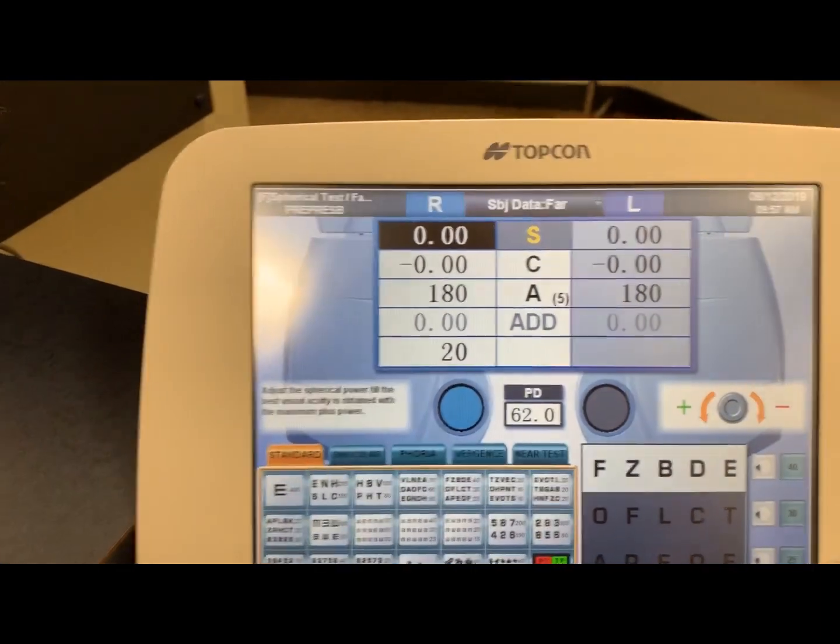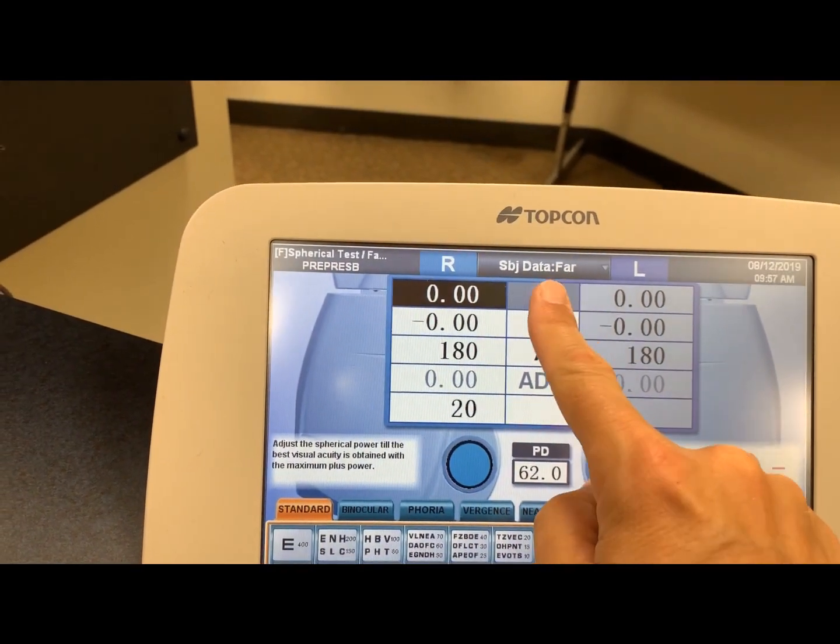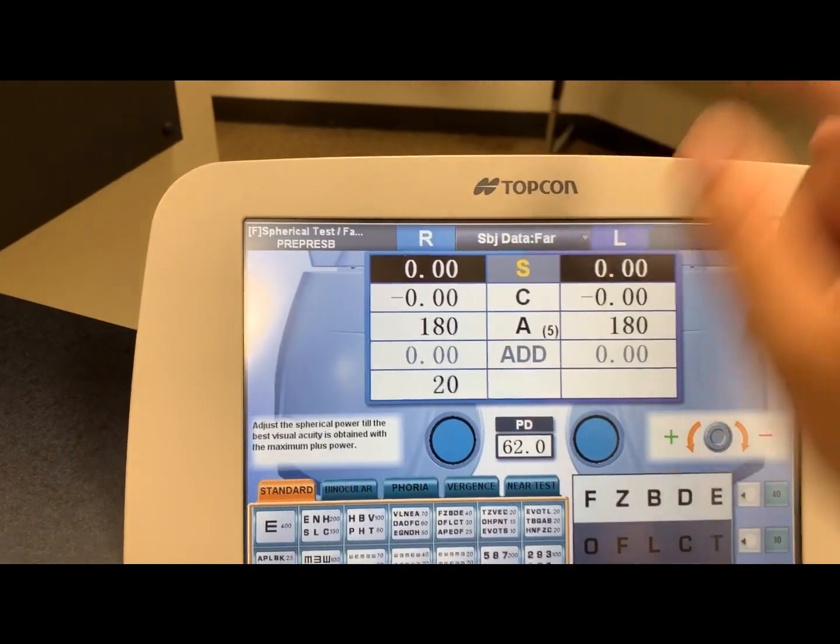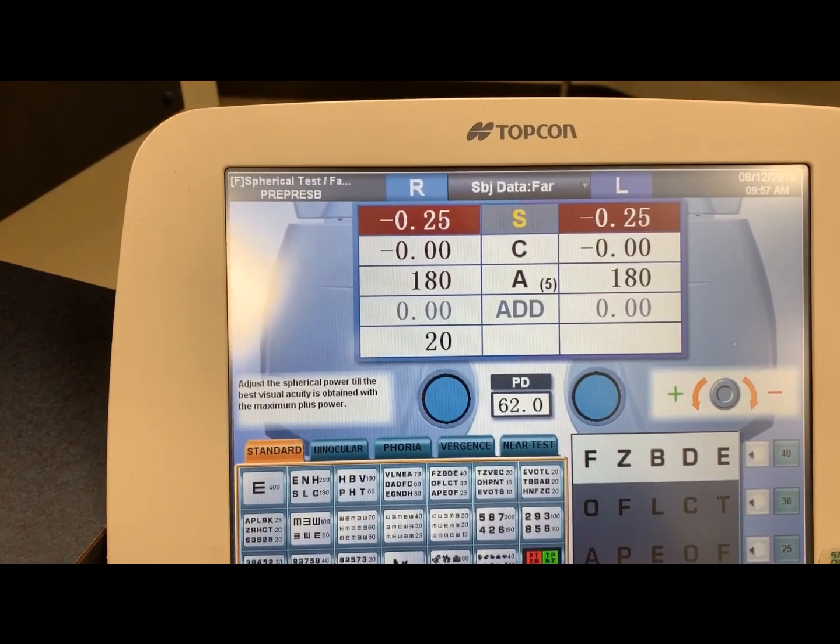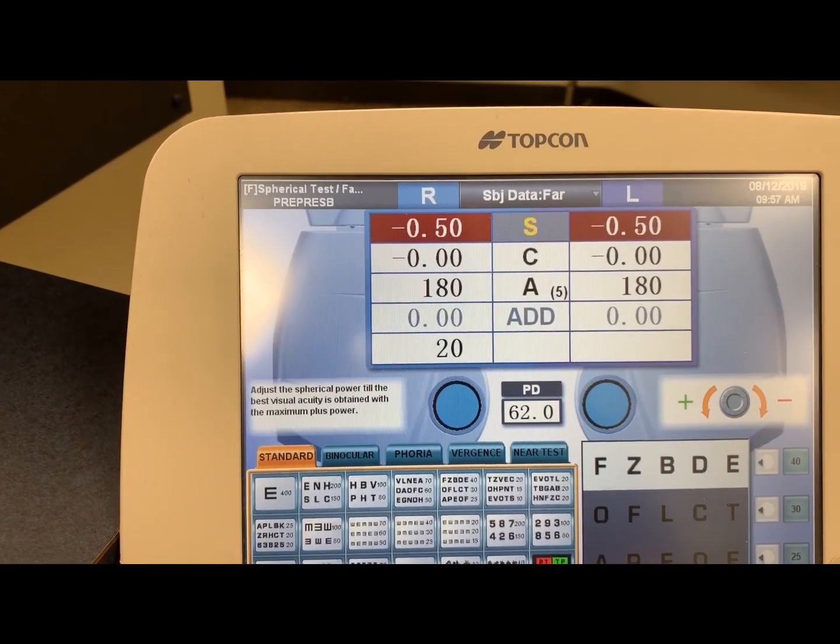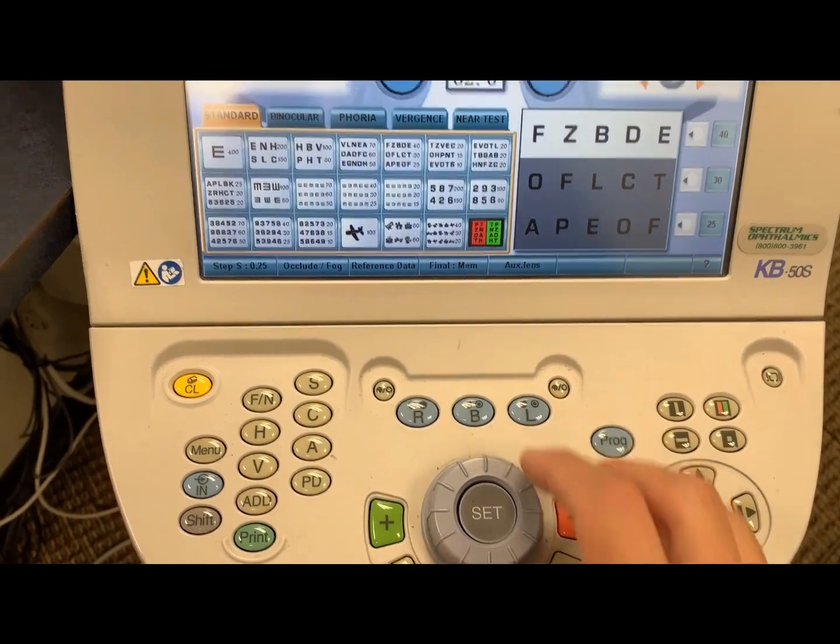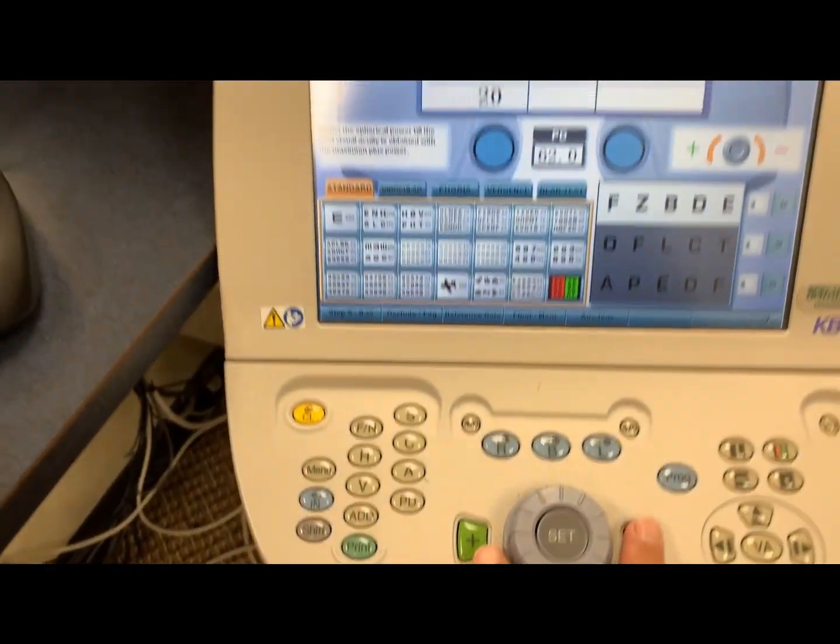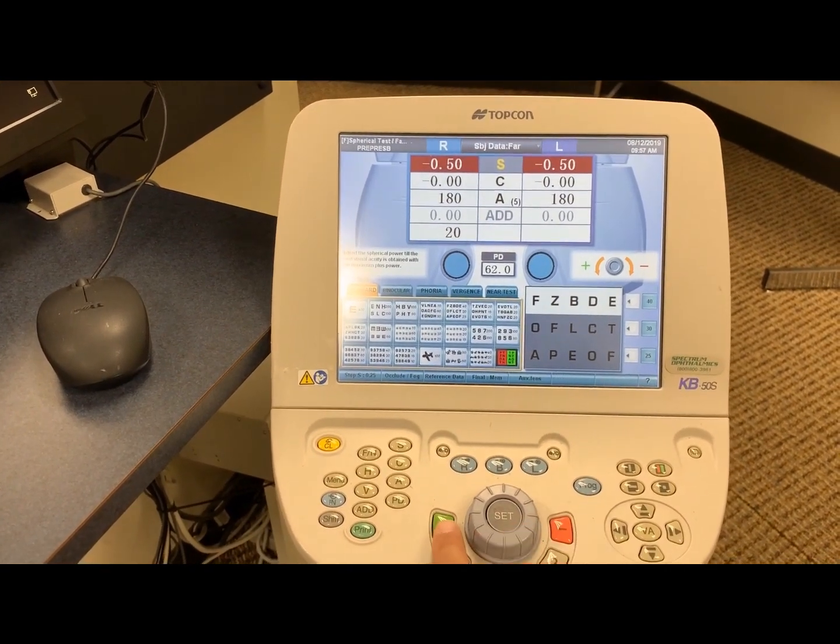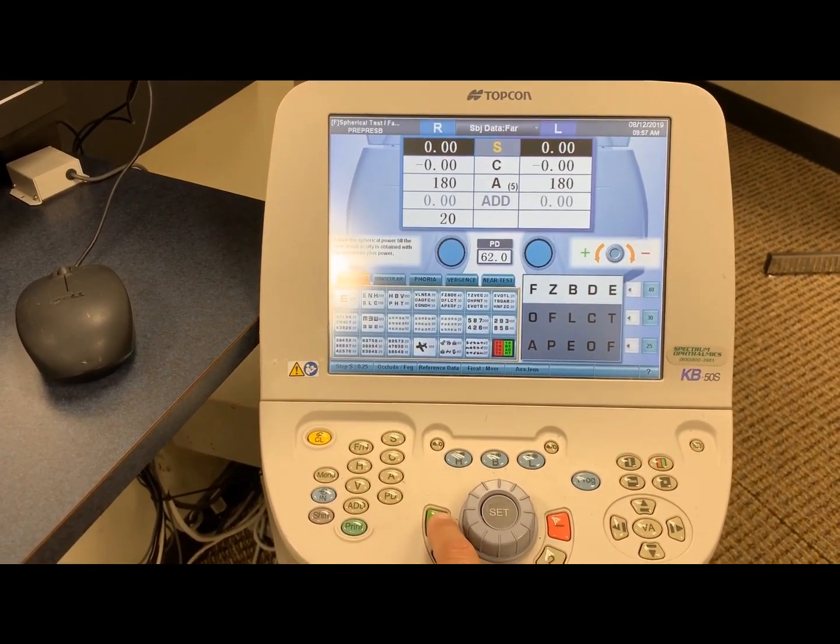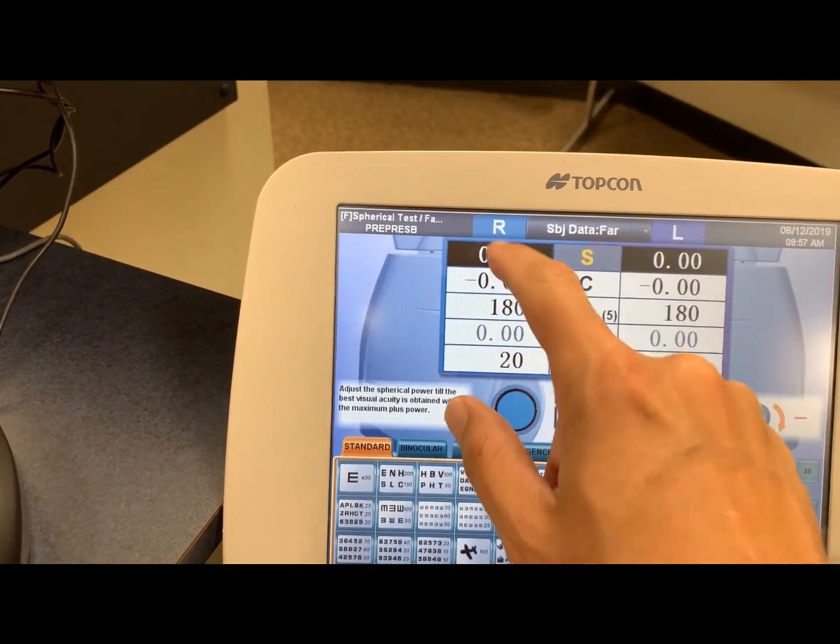At this stage, if you're wanting to adjust the spherical power, if you want to adjust both eyes, you would push the S in the center. You'll notice both black out. That tells you you're ready to adjust the power in front of each. Again, like with the Marco, turning clockwise increases the minus. Turning counterclockwise on the knob increases the plus. You can also use the two buttons at the bottom. The minus button, obviously, will give you more minus, whereas the plus will give you more plus. If you want to do just one eye, again, just like the Marco, you push just the eye that you want to test. The other side grays out, and you're able to begin adjusting just that eye.